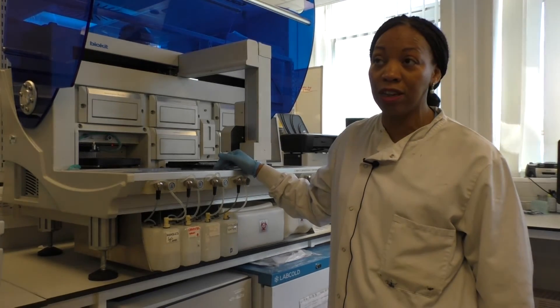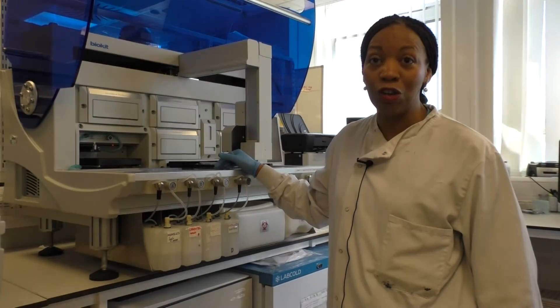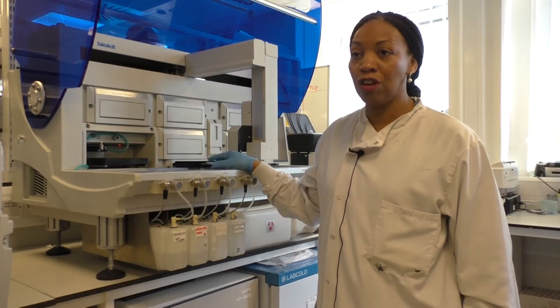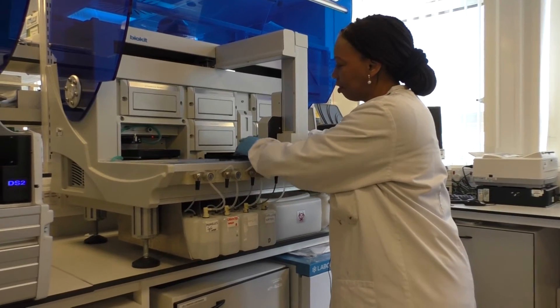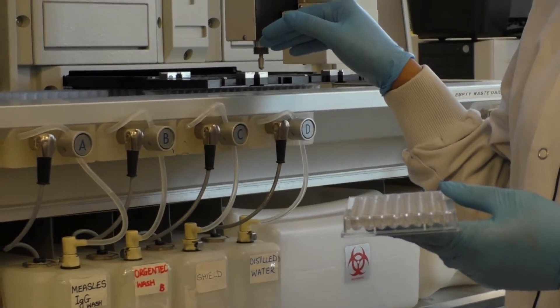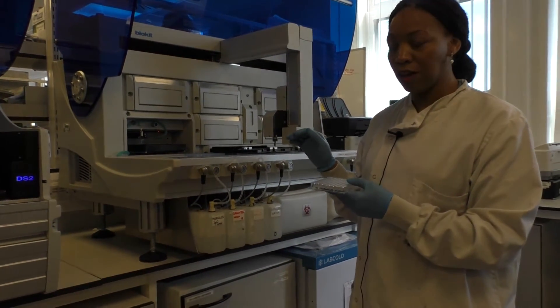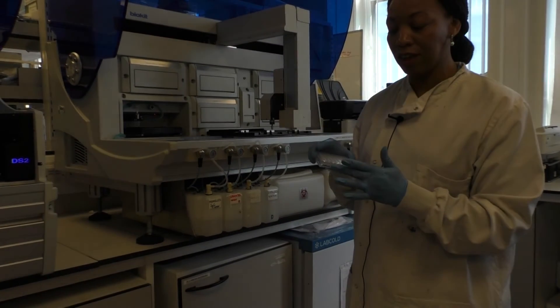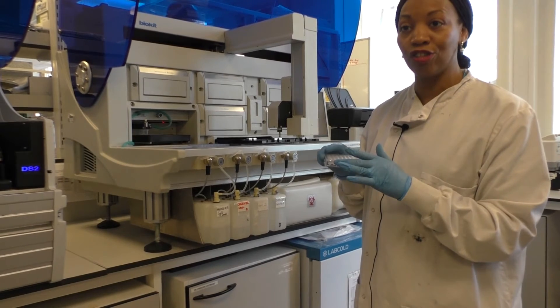Celiac disease is found in approximately one in every hundred persons in Europe. How this technique works is that tissue transglutaminase antigen is bound to the surface of a plate. The machine then takes the patient serum, which if they have celiac disease will have celiac antibodies. The patient serum is then added to the plate and left to incubate. This allows the serum to bind, and if the patient contains antibodies, they will bind to the TTG antigen on the surface of the plate.